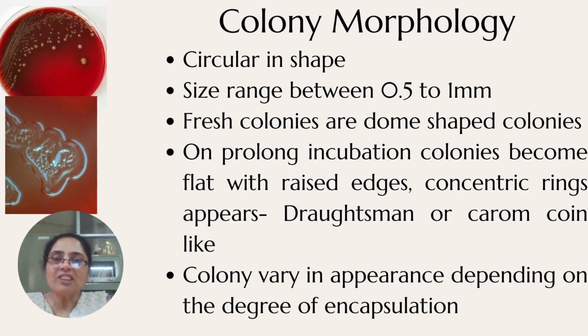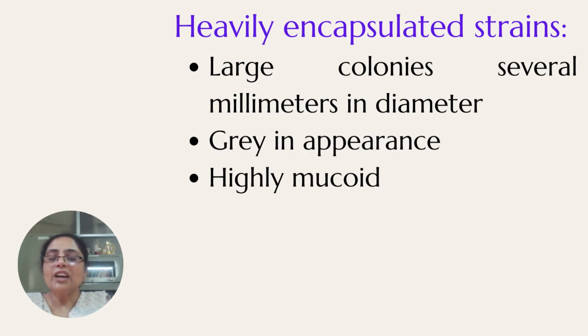Now, if the strains are the ones which are highly encapsulated, how will the colony look? The heavily encapsulated strains will be growing larger. The size of the colonies will be large. It will be grayish in appearance, and they will be highly mucoid.